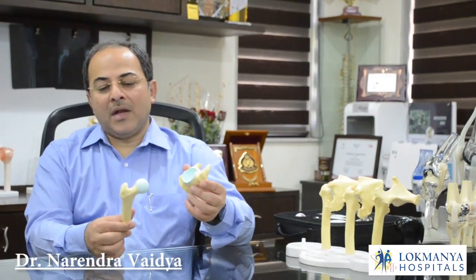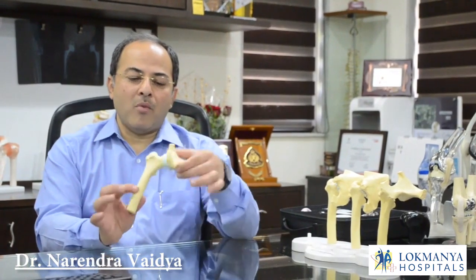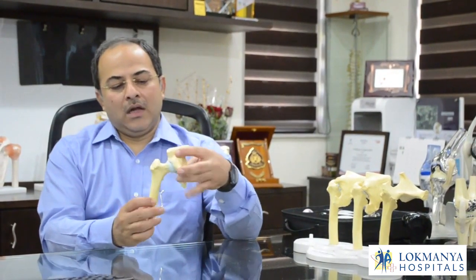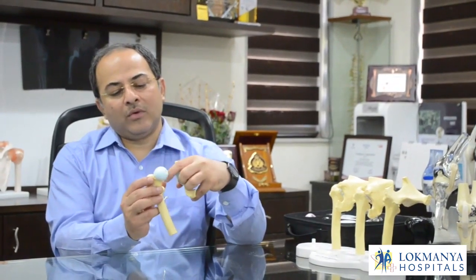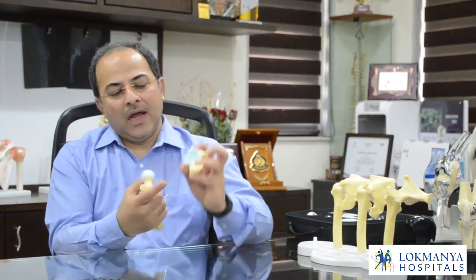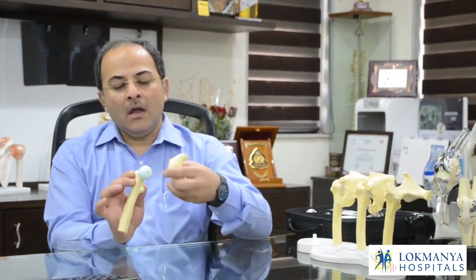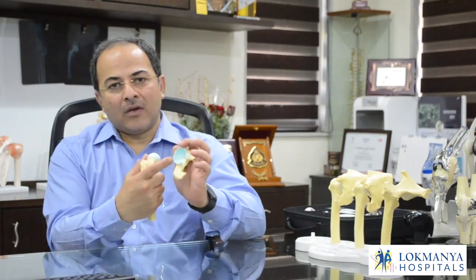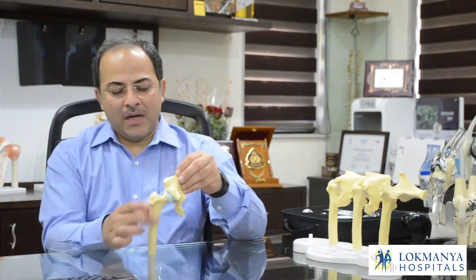Today I'm going to explain what is hip replacement. The hip joint is a ball and socket joint formed by the thigh bone — specifically the ball of the thigh bone called the head of the femur — and the socket, which is called the acetabulum. Inside, these bones are normally lined with smooth cartilage so the bones don't rub on each other.